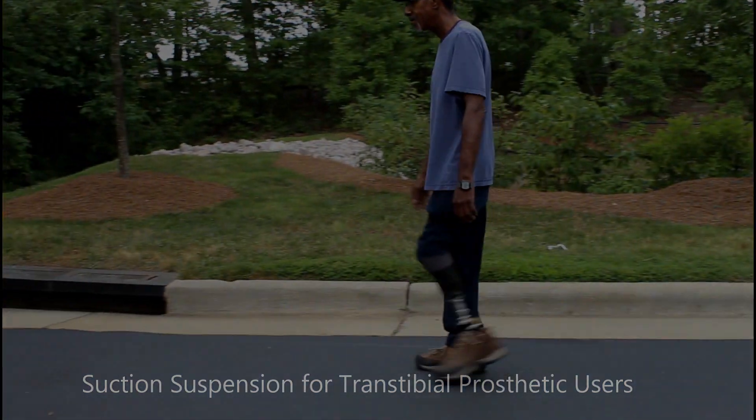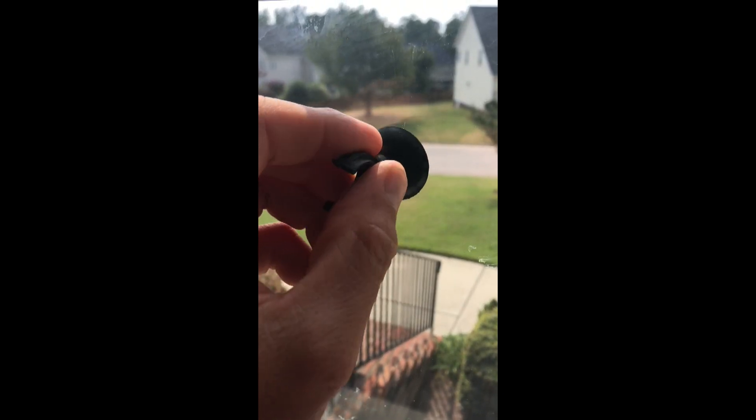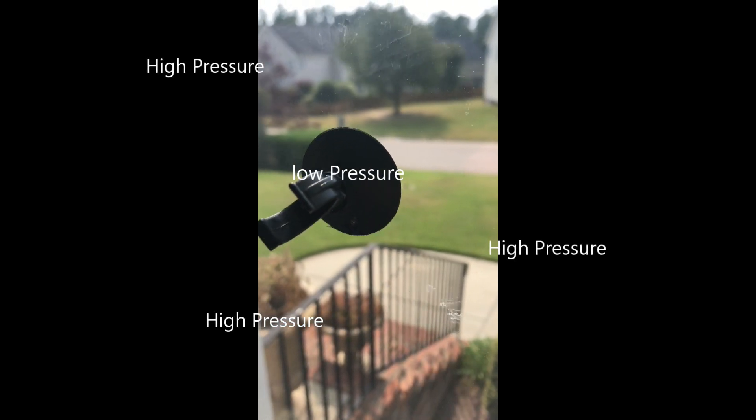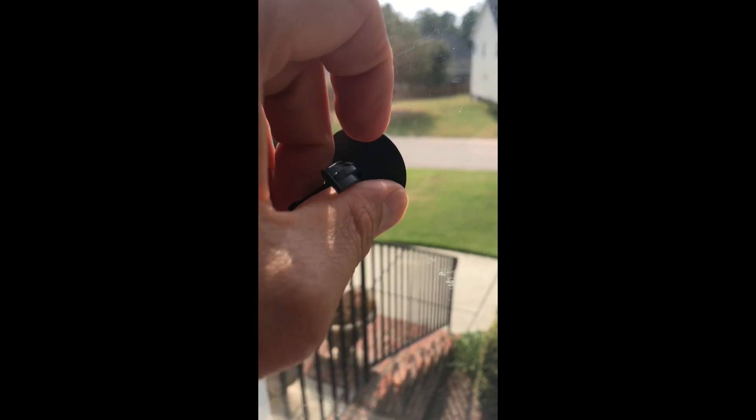In order to understand what suction prosthetic suspension is, it can be helpful to think about a suction cup that you would place on glass. As air is depressed out of the suction cup, it creates an area of lower pressure beneath the suction cup than the surrounding atmospheric pressure. This pressure difference is what holds the cup in place until air re-enters the system.